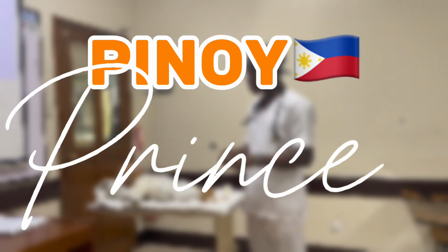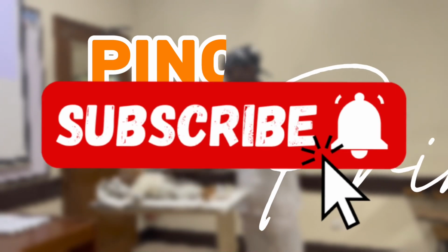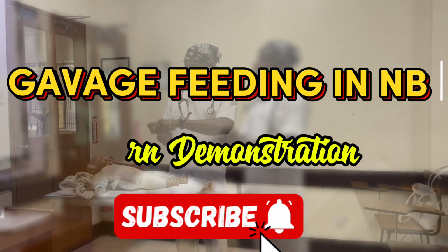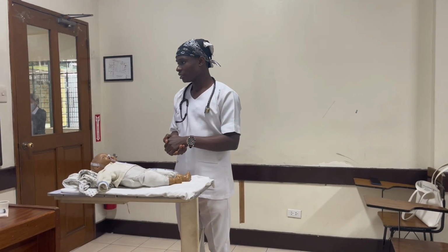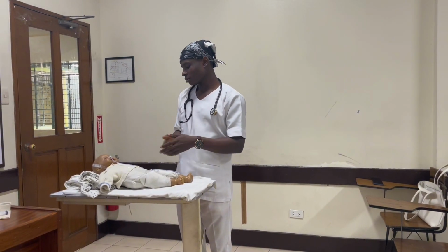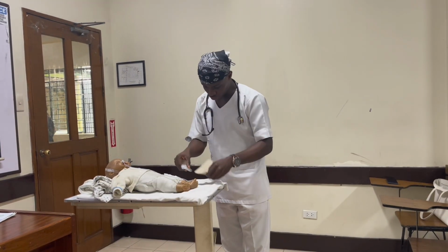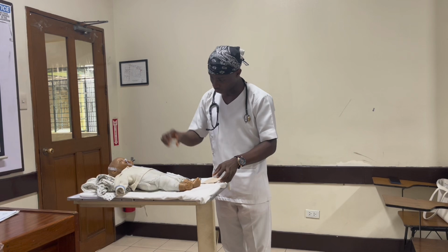So, and also, while feeding the baby, there is something I forgot to say. You should make sure you wrap the baby to avoid his or her hand obstructing the feeding. So I really want to do the gavage feeding, dropping it accordingly. This is the tissue, this is the syringe, then this.